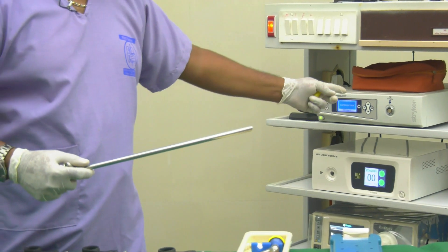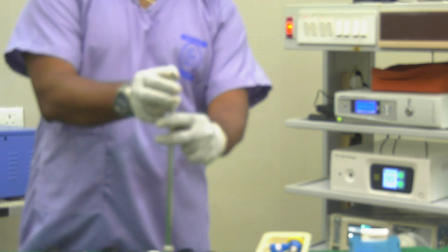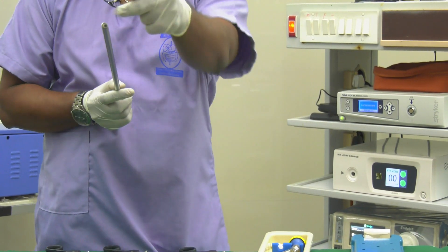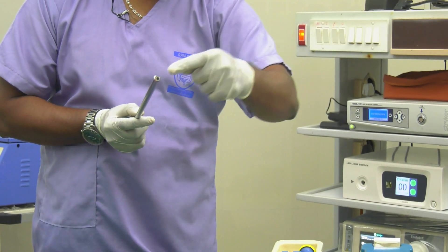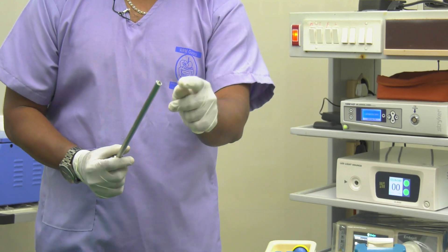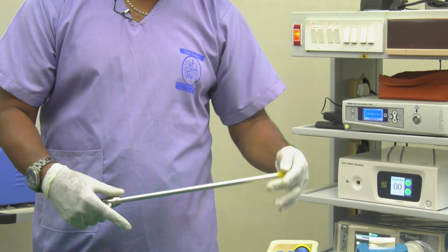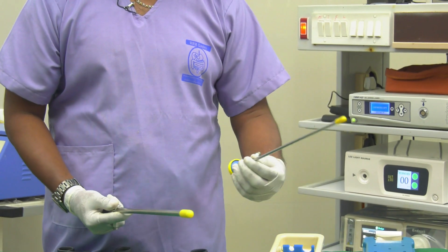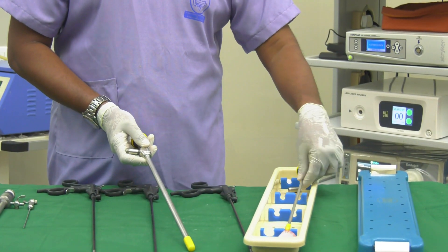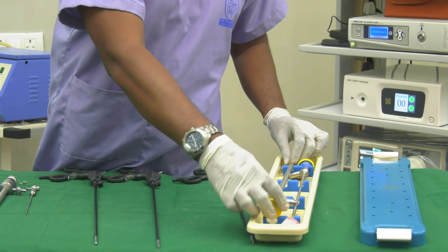Whatever I am seeing inside the abdomen, I can see on this monitor through the scope. This is a 30-degree scope — if you observe closely, it is not straight but angled, which is helpful in laparoscopy to look up and down at structures. There are also zero-degree scopes. I have two scopes: a 10mm and a 5mm scope, used for major and minor surgeries respectively.